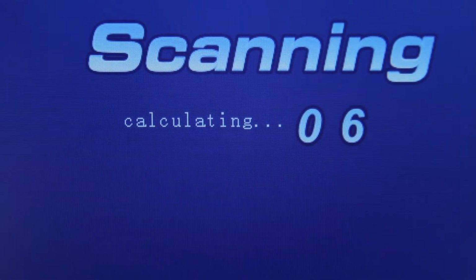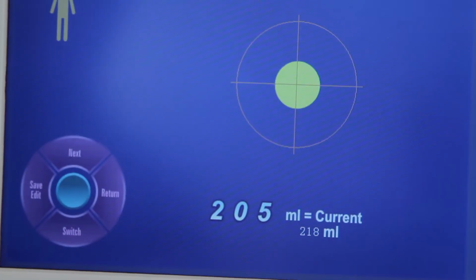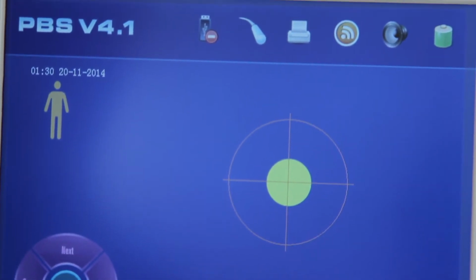1/12 means it is scanning the first of 12 images. It will then enter the calculating screen after the scan is complete. Calculating 12 means it is scanning the 12th image. The scan results screen displays the results of the scan.